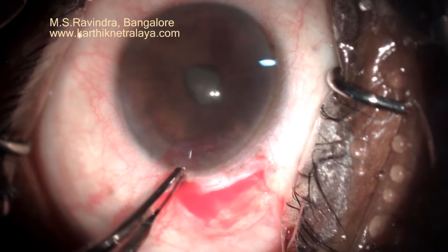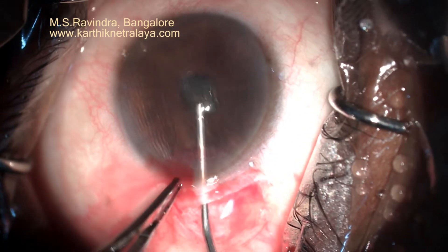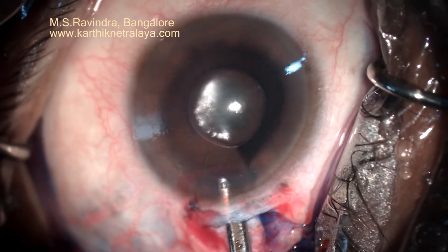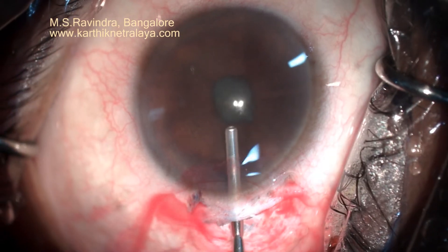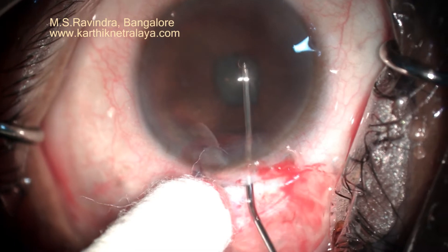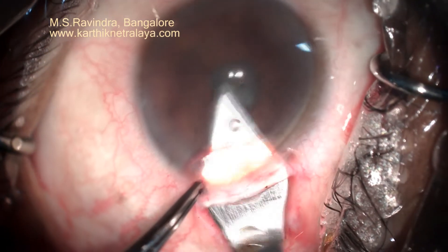A small 2 mm nick is made into the anterior chamber through which I am going to inject air followed by trypan blue dye, so as to stain the capsule wherever possible, at least in the central area. After injecting viscoelastic, I am releasing the posterior synechiae with blunt dissection.